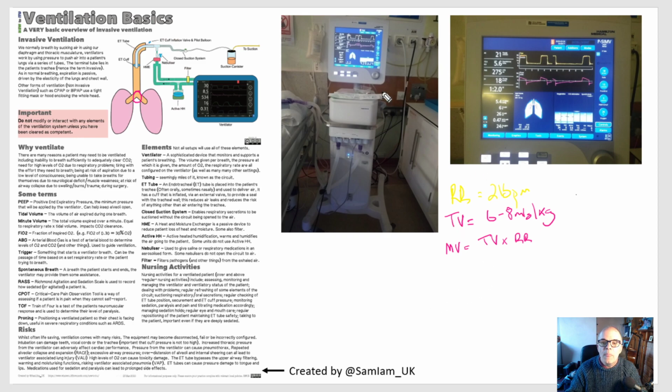Okay. The other important thing that we're going to set is going to be their FiO2. So FiO2, what does that mean? Well, FiO2 is fractional inspired oxygen. So basically, what percentage of oxygen are we giving them? So if you hear FiO2, just think oxygen percentage.